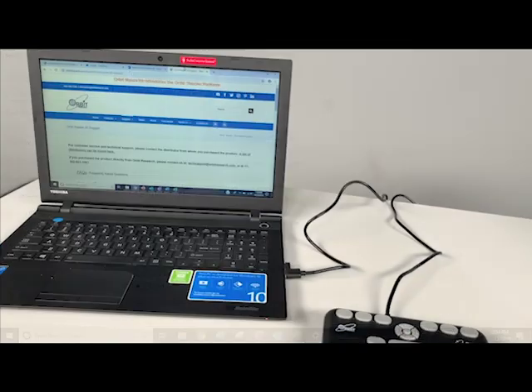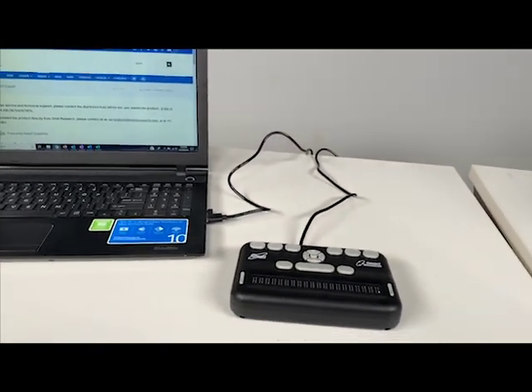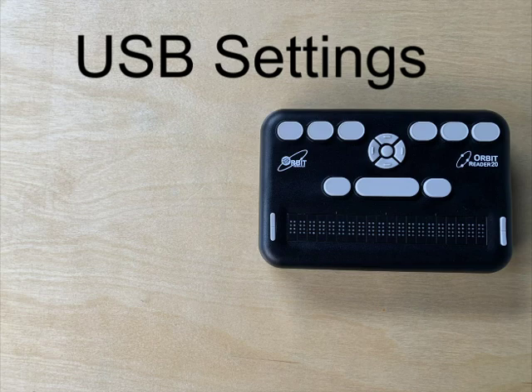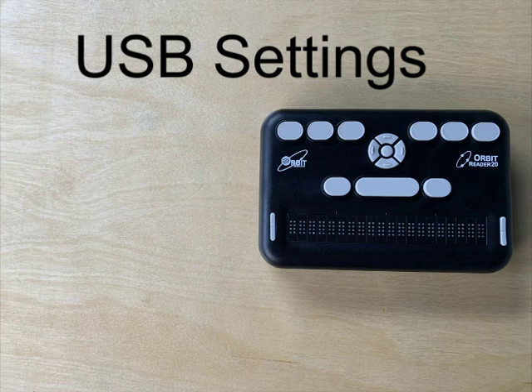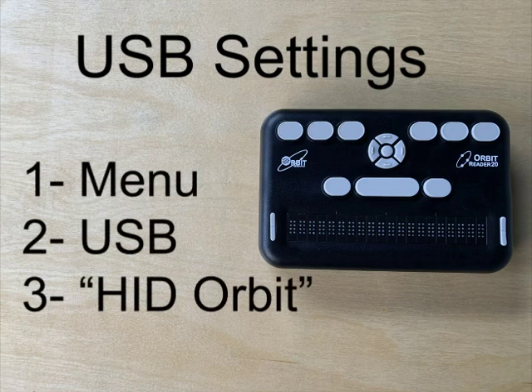Your Orbit Reader 20 can connect to your PC by USB connection. To connect with USB, ensure that your USB setting is set to USB HID Orbit protocol on the Orbit Reader 20. To check, go to the menu, then USB, and then select HID Orbit.